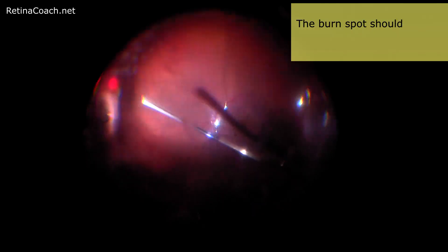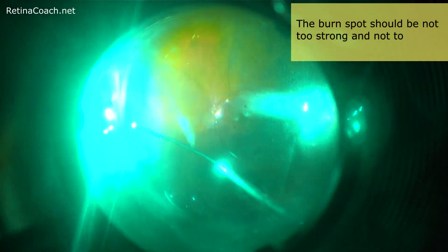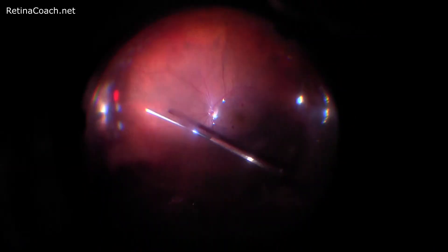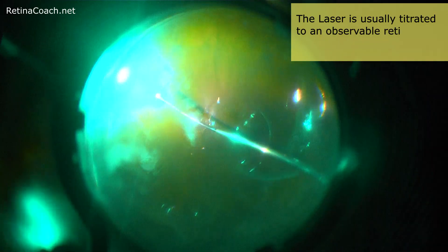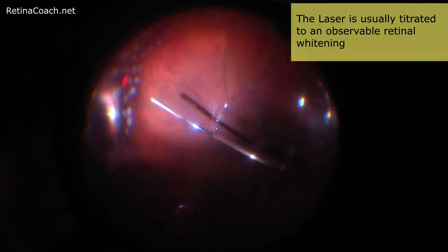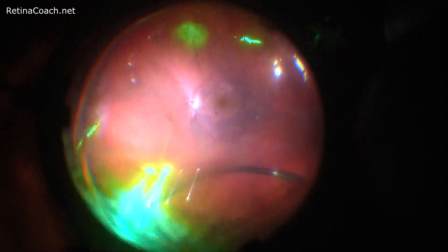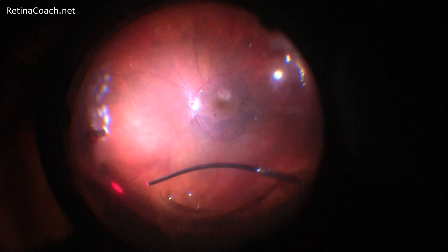Third, the burn spot should be not too strong and not too large. The laser is usually titrated to an observable retinal whitening. The size of the spot, the power, and the duration can be set in advance in the vitrectomy system and regulated depending on the case.